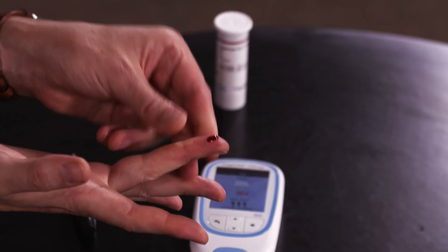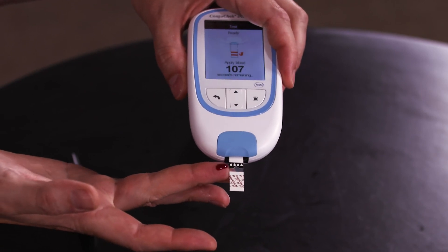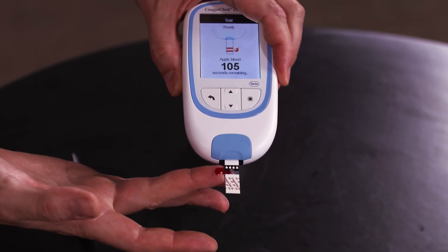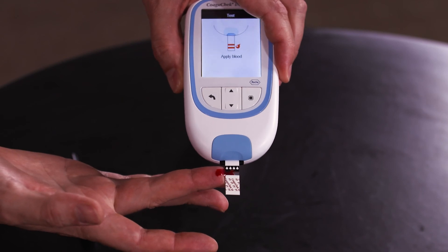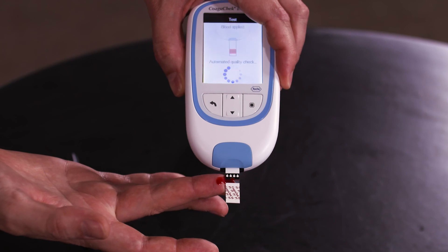Please make sure you apply the first drop of blood within 15 seconds. If the test fails, for example due to a sampling error, please repeat the test using a new strip and fresh sites for lancing. Lancets are single use and should be disposed of appropriately after every test.